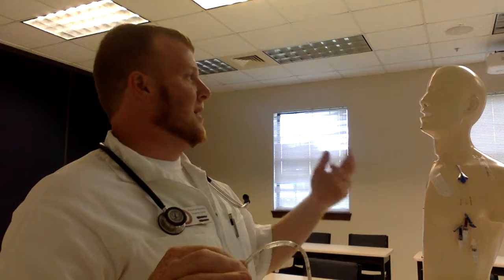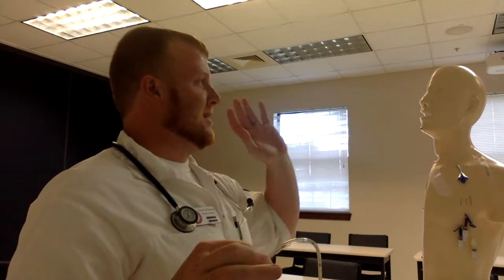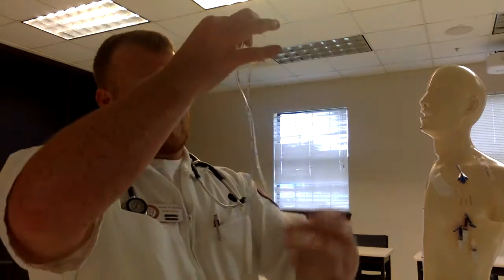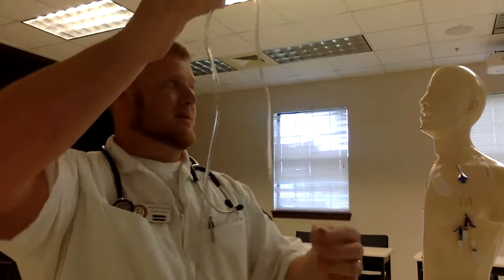Make sure that they're not gasping for air or anything like that. Just read your patient — the patient is the best one to tell you if something's going on. The end of the tube is now obviously contaminated. You have your gloves on, but the end of it, if it needs to be cultured, we're going to send it off to the lab in a biohazard bag. Make sure that the catheter is still intact, that there's nothing left in the patient that could possibly be aspirated or whatnot.